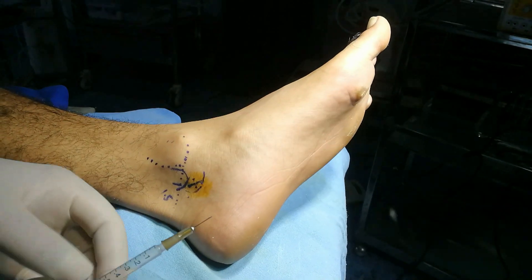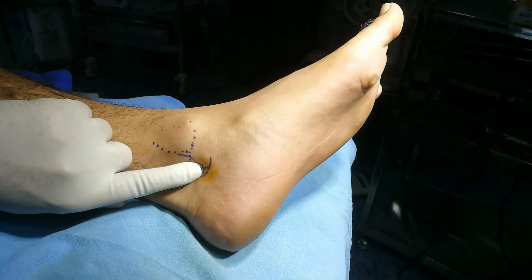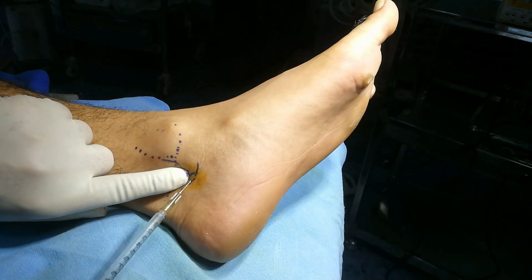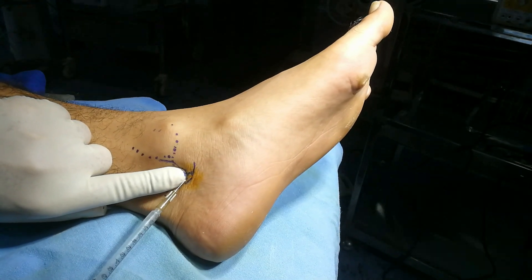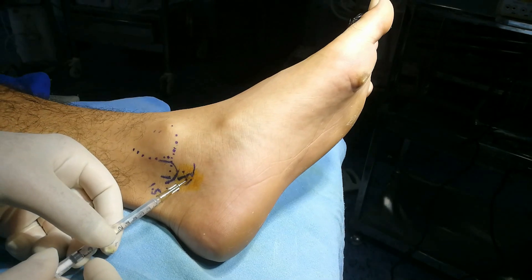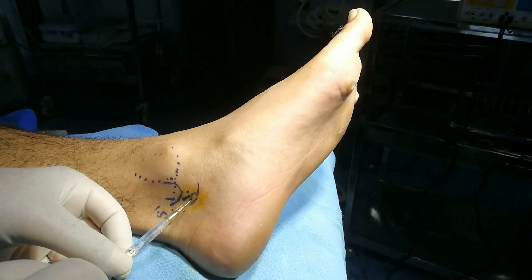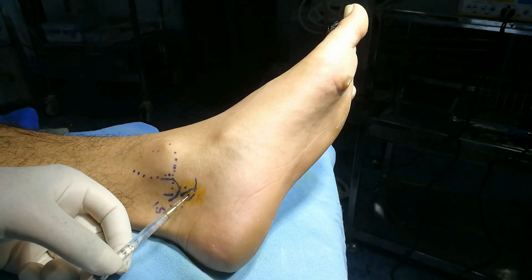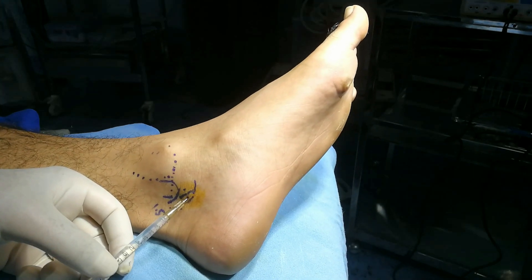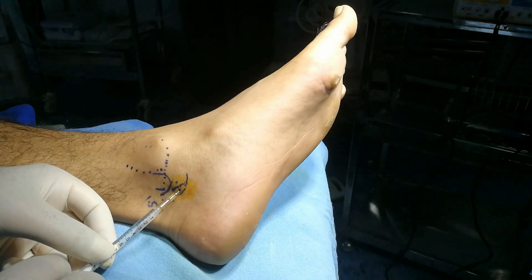Use a 1 ml syringe with a 26-gauge needle. The tip of my finger is over this artery — inject on either side. I have taken 2 ml of 2% lignocaine without adrenaline, because I want a short duration of anesthesia. Aspirate and then inject.